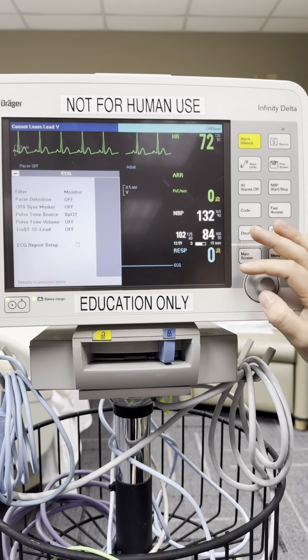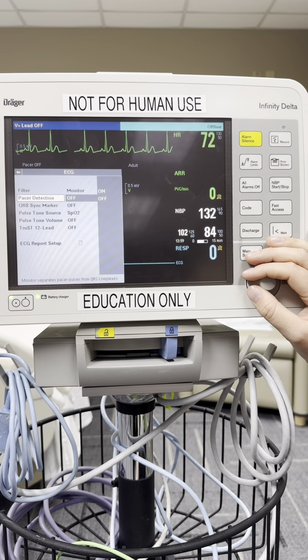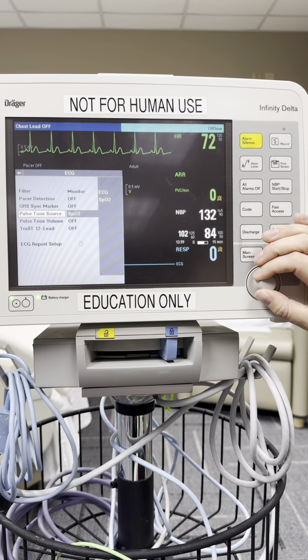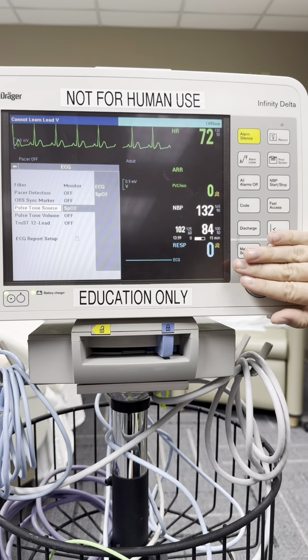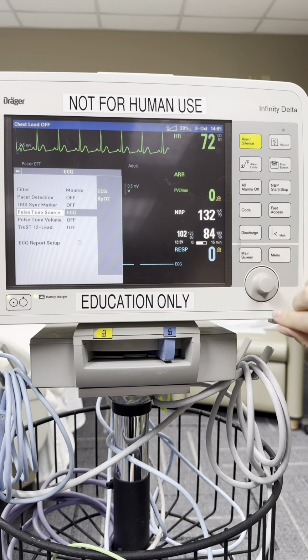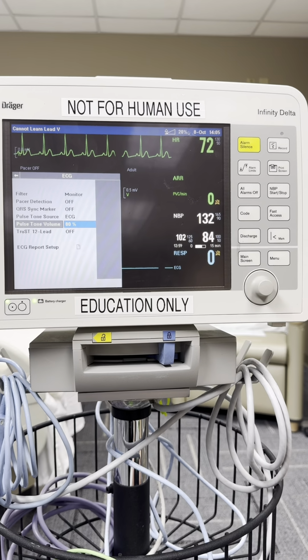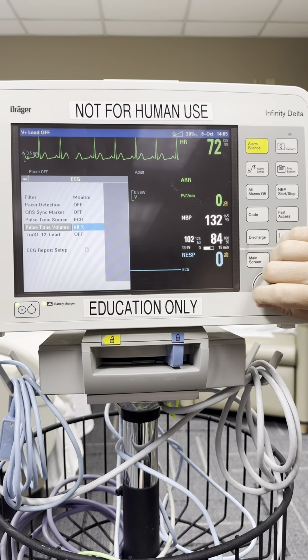In your options button, this is how you turn on the pacer. If they have a pacemaker, then you have to have the pacer detection on. That's how you get your blue spikes. The pulse tone source, so you can see it's set to SpO2, but if we switch that to the ECG, and then we turn our volume on, that's when you're gonna have that tone with each beat. But we don't like that, so we're gonna turn it off.